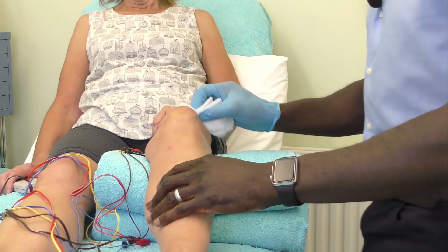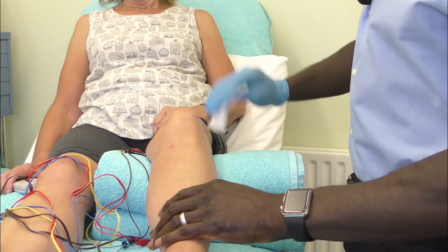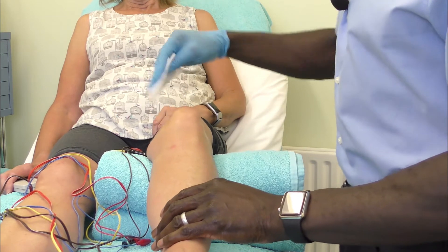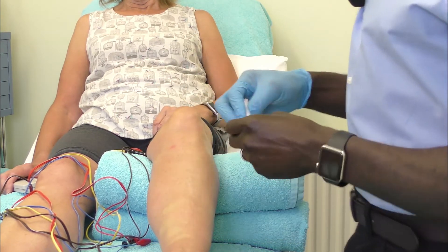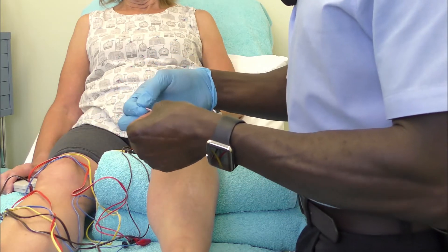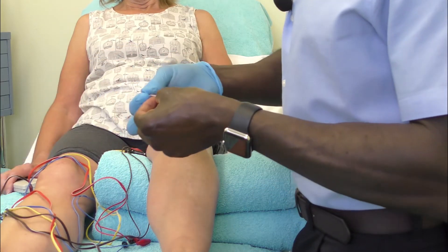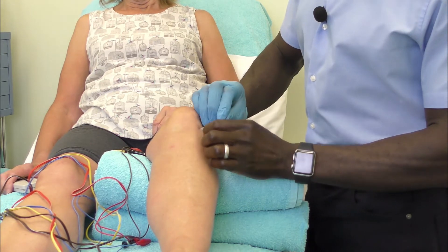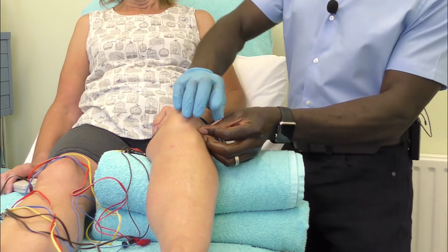The best thing to do is to use the surround the dragon technique, but it's important that you think about what points you're actually going to use to surround the dragon. We'll start off with the two main points, which are the eyes of the knee — mainly the one on the lateral side being Stomach 35.